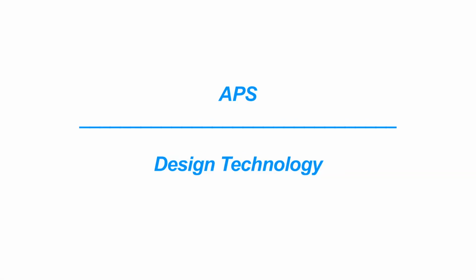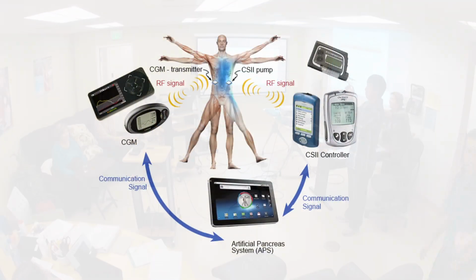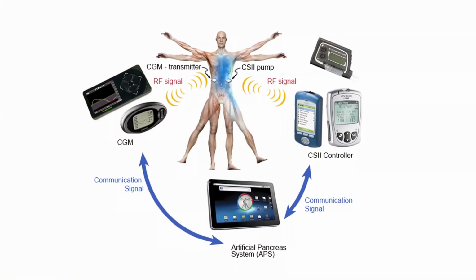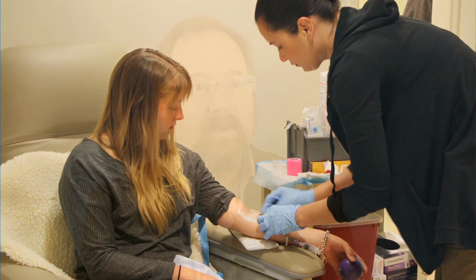We created something called APS, Artificial Pancreas System, approximately 5 years ago after we got our first grant from JDRF, Juvenile Diabetes Research Foundation. JDRF recognized that we can use technology not so much as a cure, but to help glucose control to improve lives of people with type 1 diabetes until there is a cure. In essence, we're trying to automate insulin delivery for patients with type 1 diabetes, so they don't have to worry about how much insulin to take throughout the day and overnight, etc.